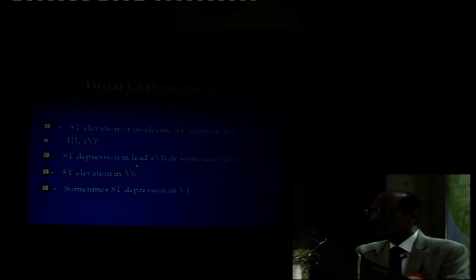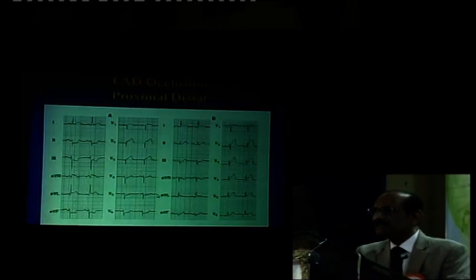ST depression in lead AVR and sometimes in AVL, ST elevation in V6 and sometimes ST depression in V1. Let us see the ECG here in proximal LAD occlusion.